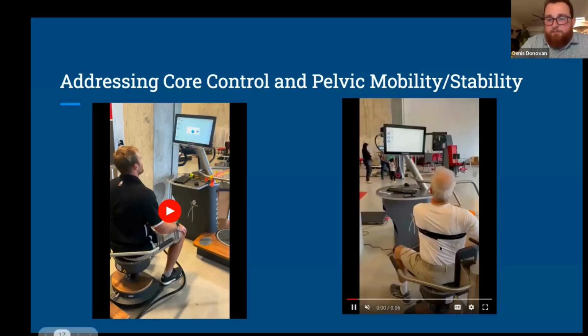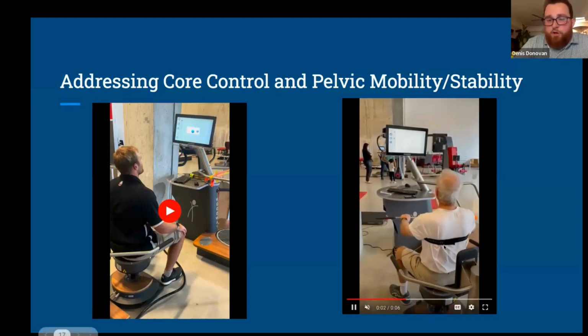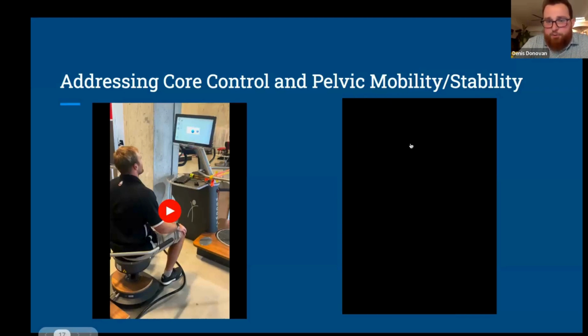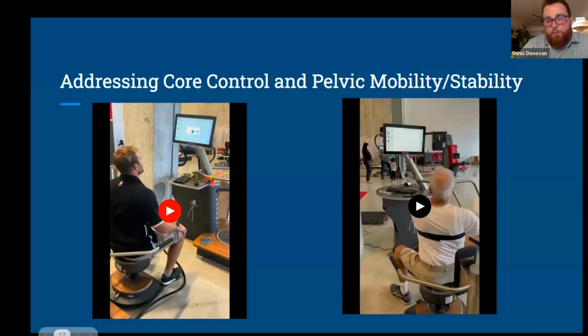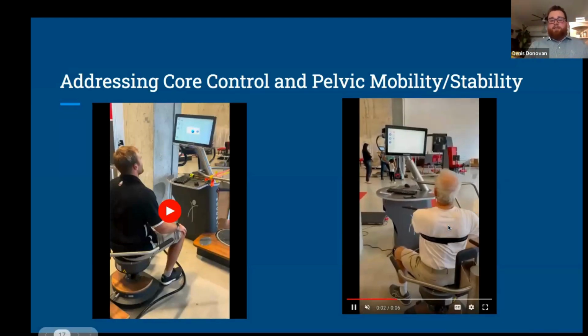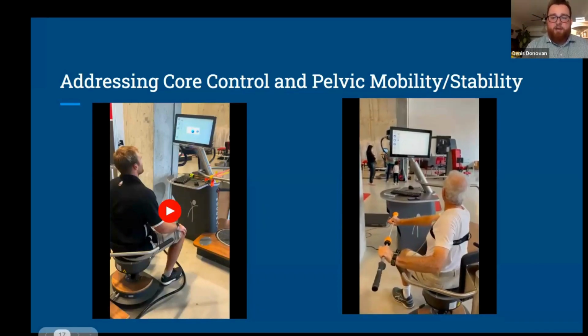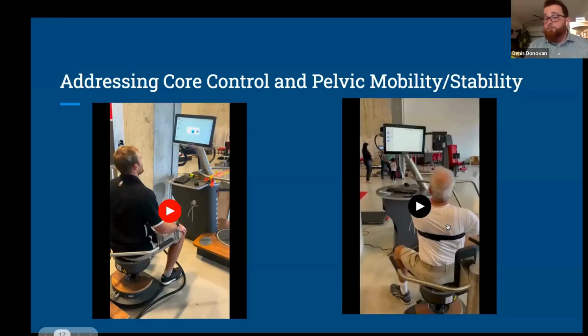In this video, I have a golfer trying to do the exact opposite. The video is not great, and I apologize for that, but he sees two plus signs on that screen, a purple one for his pelvis and a red one for his trunk. I'm asking him to keep his pelvis steady there and rotate his trunk as far as he can, right and left, allowing that red dot to move around a stable pelvis. Love utilizing the biofeedback here to help the patient strengthen that mind-body connection.